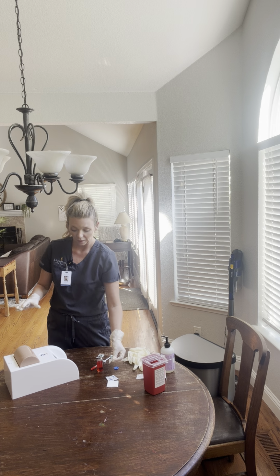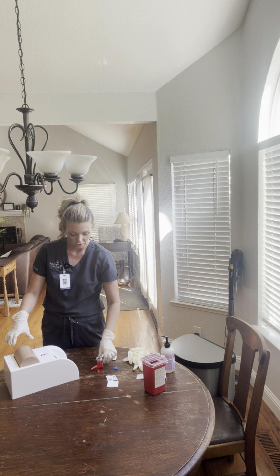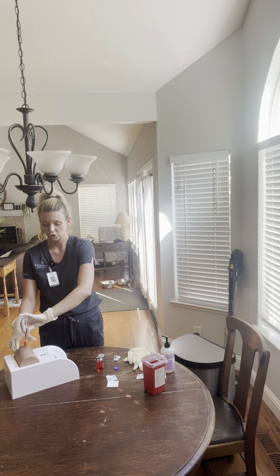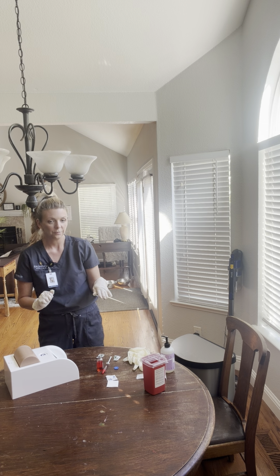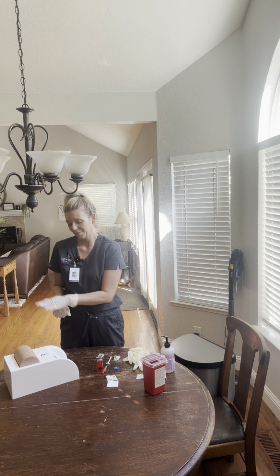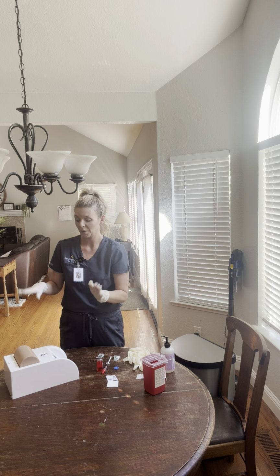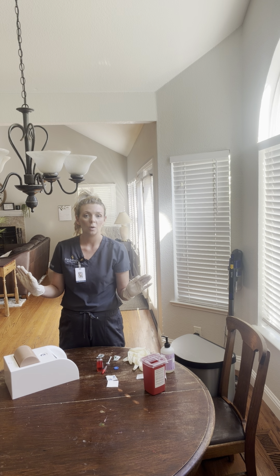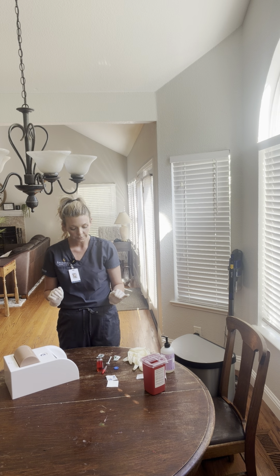Before I did that, I was able to pinch the skin and I measured with my needle that I had about 1 inch around. That was a good site. So that is something that I forgot to do, but I'm adding that in there. And I don't want to compromise the sterilization of my patient's skin. So that is good. So I'm going to let that air dry. We do not want to wave our hands on it or blow on it. It needs to air dry on its own.